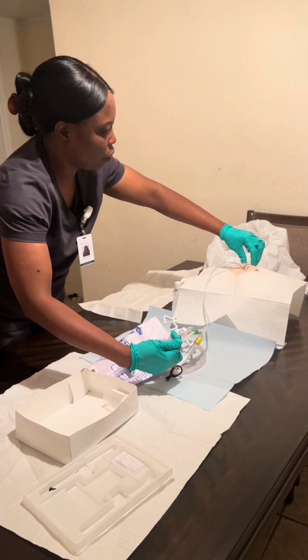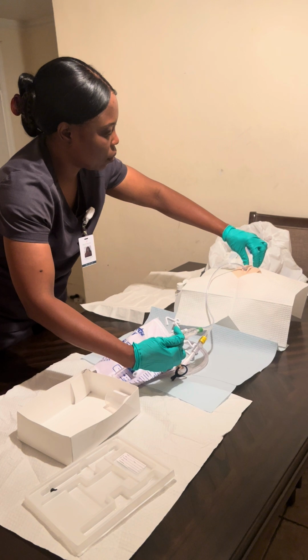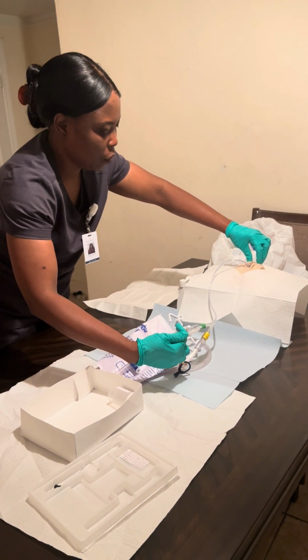Please let me know if you feel any discomfort, if you feel any pain.